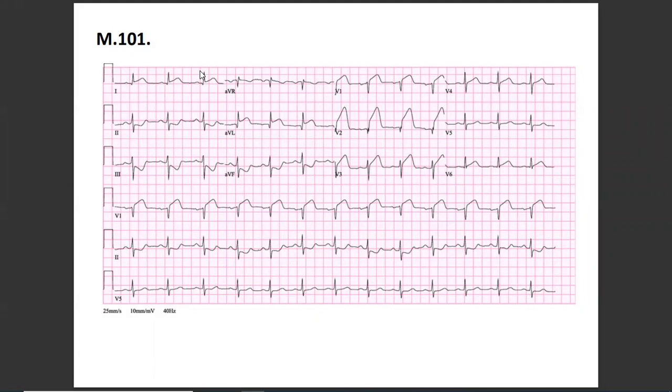Okay. Looks like we have elevated ST segment. So it's slow, step by step. Okay, let's go through the whole evaluation. First, you said rhythmicity, fine. After, you say the heart rate, fine. After, you can figure out the axis, I don't care about it. It's okay, you can do it.